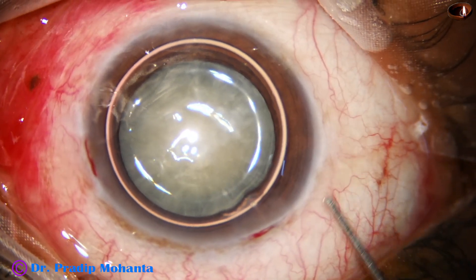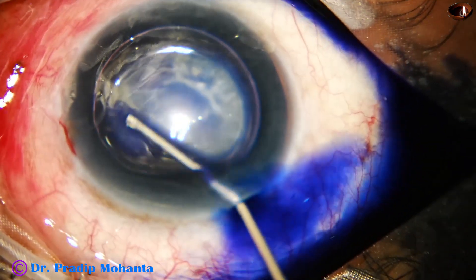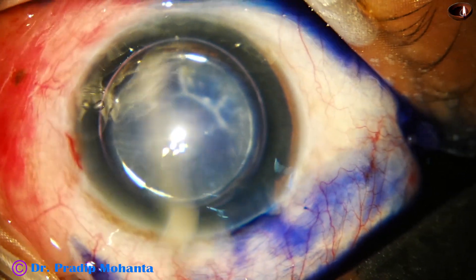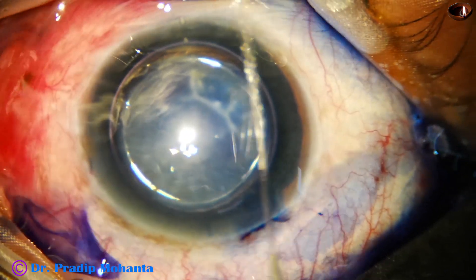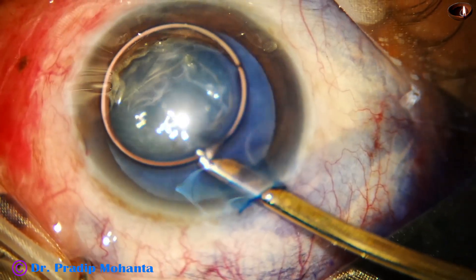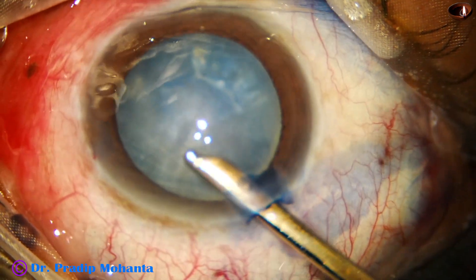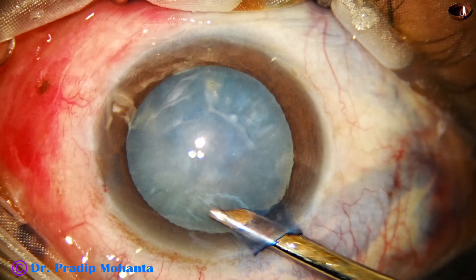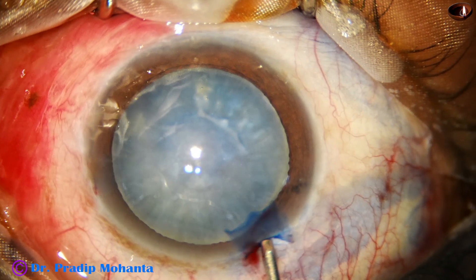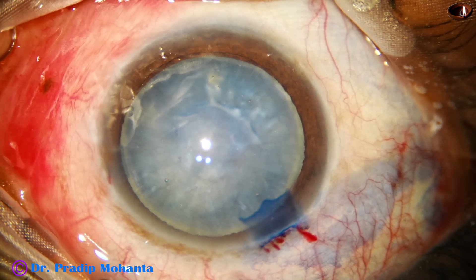An air bubble is injected into the anterior chamber. Beneath this air bubble, trypan blue dye is applied over the anterior capsule, and we can make out by the contour of the anterior capsule that there is anterior capsular fibrosis. Now the Simcoe cannula is used to wash the dye and we see that there is very nice staining of the anterior capsule. The anterior chamber is then filled up with 2% hydroxypropylmethylcellulose.